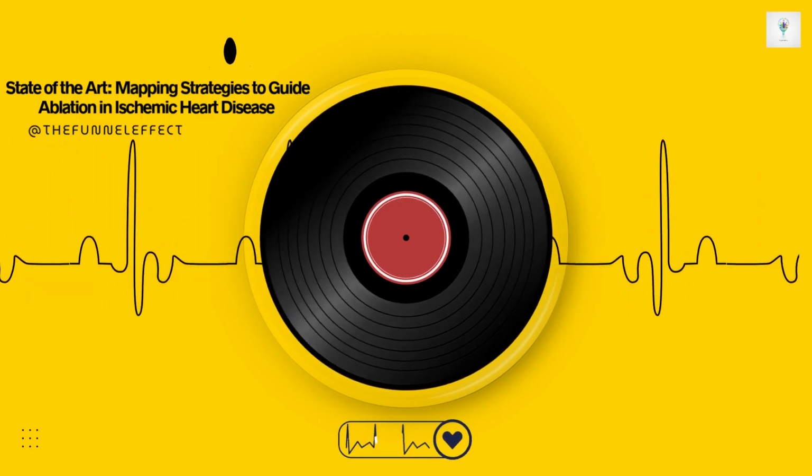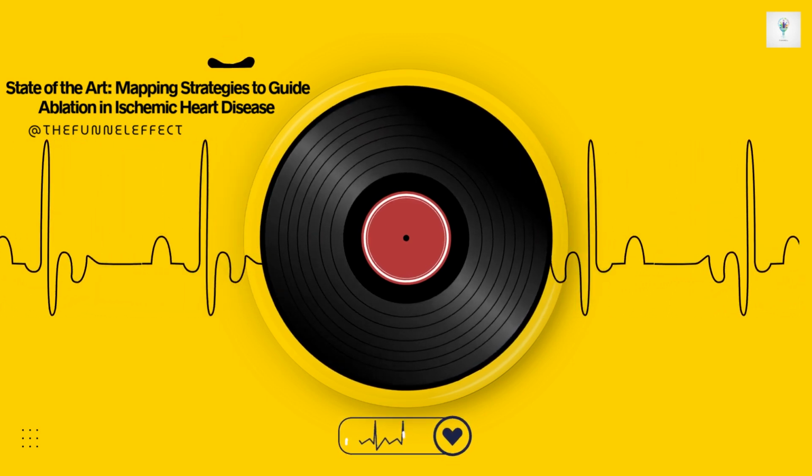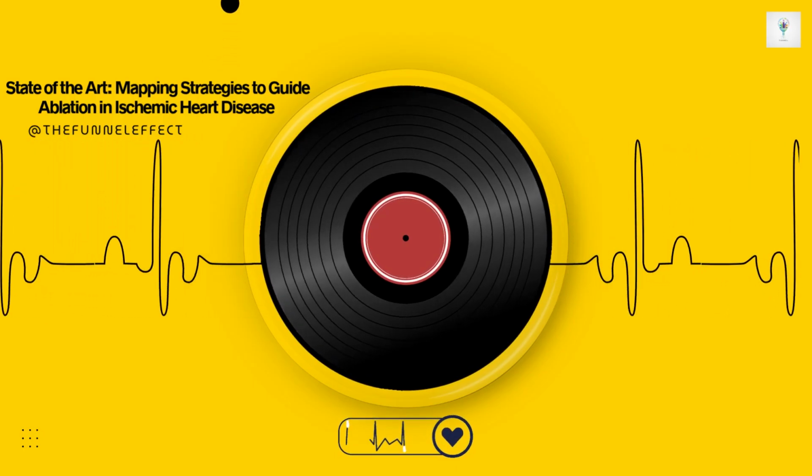Okay, we've covered static markers, voltage, resting EGMs. Now we shift to something more dynamic: functional mapping. This involves actively provoking the tissue to reveal hidden problems. Why is stressing the circuit like this so useful?